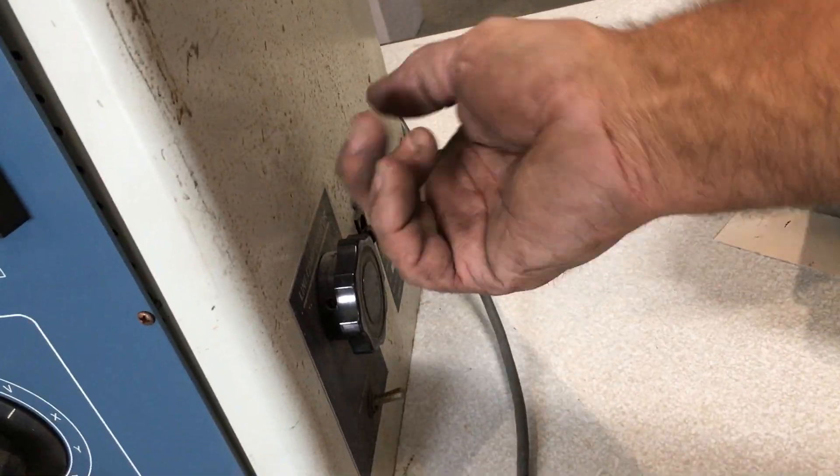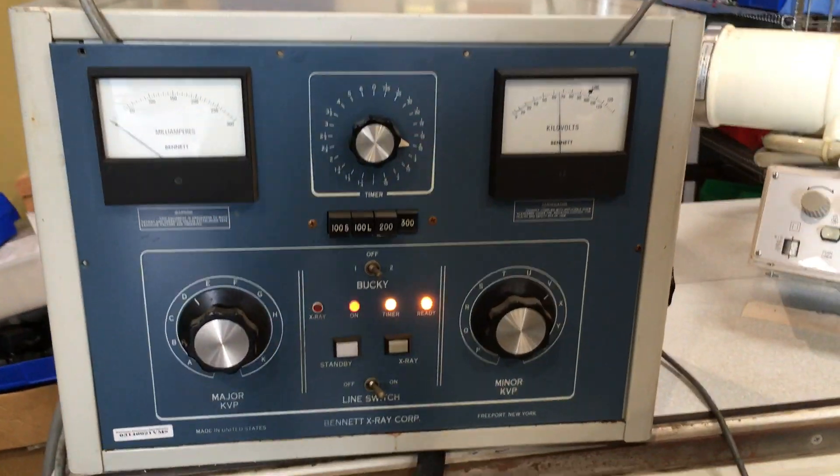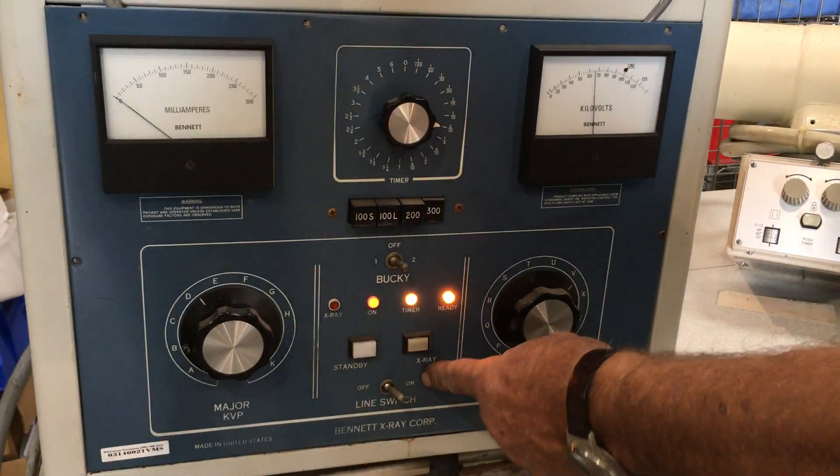Here's your on/off switch on the side. The lights will illuminate. This is also an on/off switch, so it must be on.